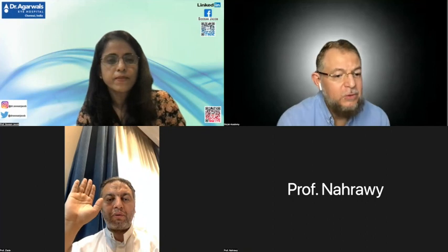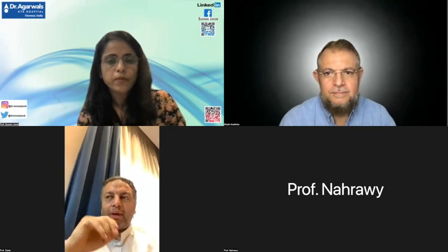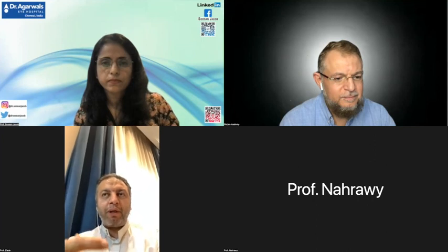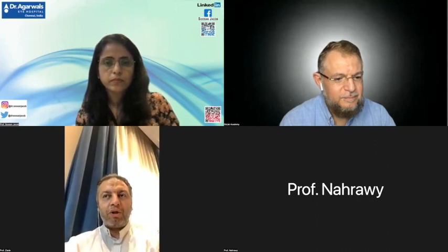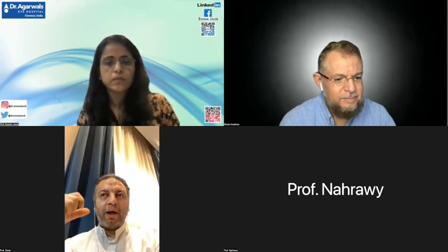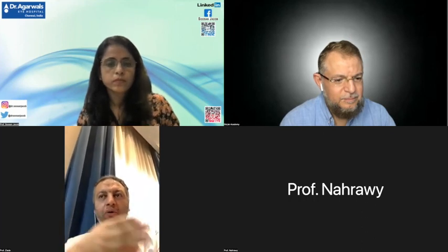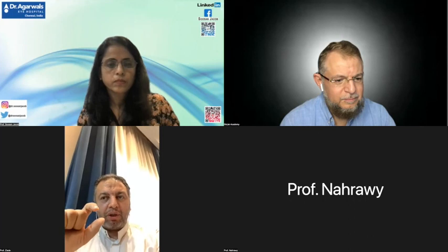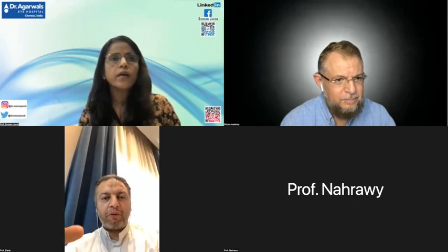We enjoyed very much. Yeah, please. Dr. Mazen, Dr. Soosan, I would like to ask about the remaining part of the corneal button after having the central corneal graft. This remaining button will be suitable for CAIRS. You know that we have a problem in having the corneal grafts. So if I used the corneal donor graft for a case of PKP or DALK, and the remaining part of the corneal tissue with the sclera, can I have the CAIRS from this part, the peripheral part of the cornea?